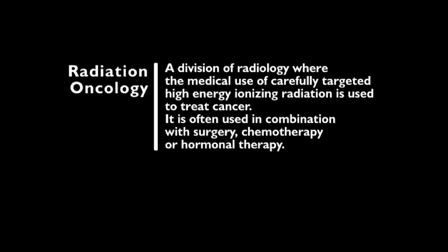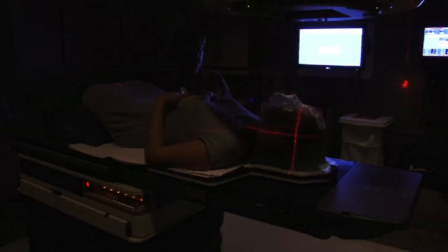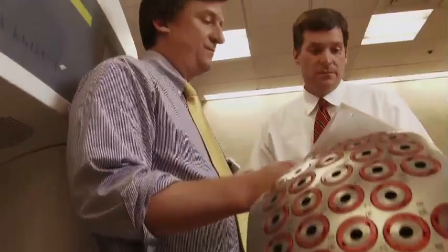In radiation oncology, we are using X-rays to cure patients as opposed to diagnosing patients in the radiology department. So the doses are substantially higher. When the patient first arrives in our department, we usually do a complete history and physical examination. And in conjunction with other specialists who are treating that particular patient, we formulate a treatment plan with the help of dosimetry and the excellent physics department that we have here.